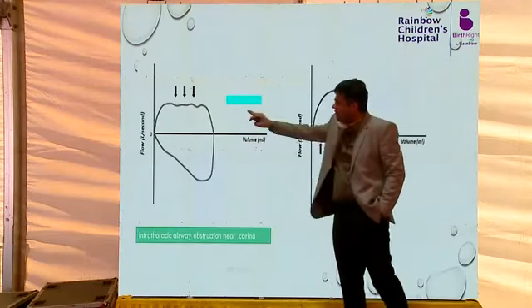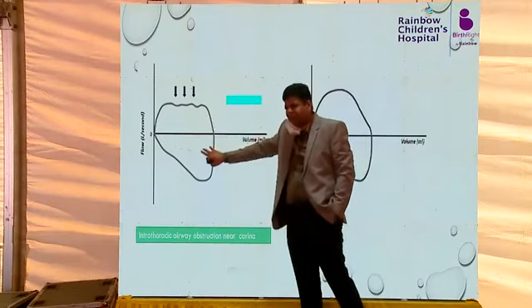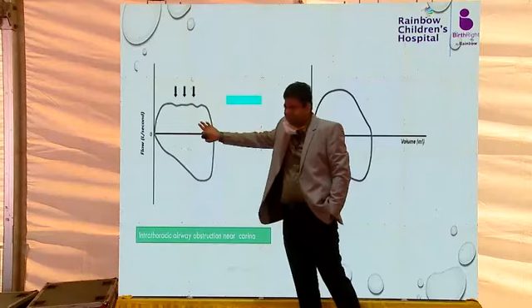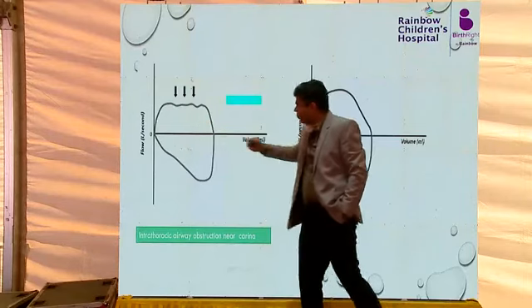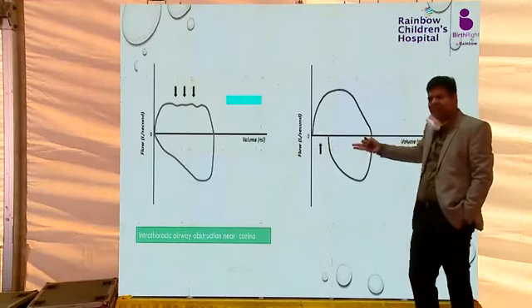So if only intrathoracic obstruction is there, this we don't see commonly, but intrathoracic obstruction can be seen in pneumothorax cases. Okay. Then this we have discussed, leak.